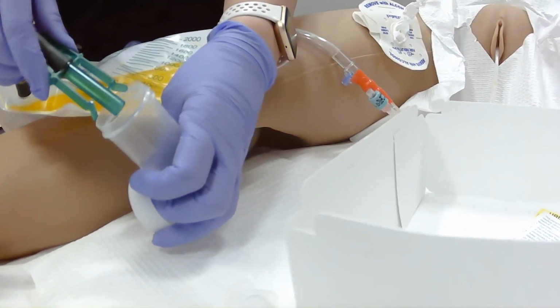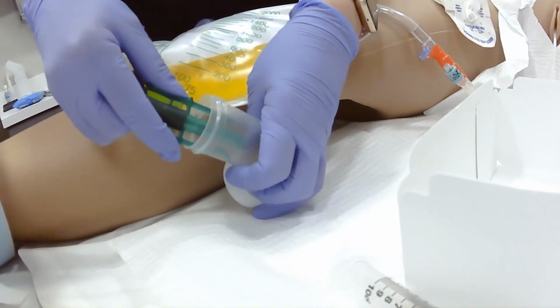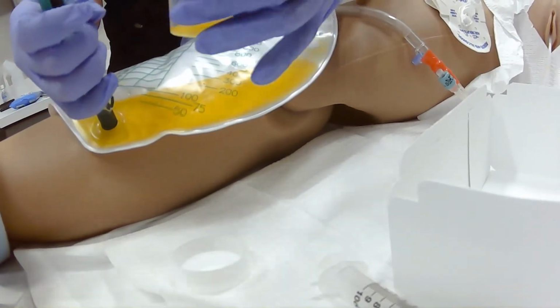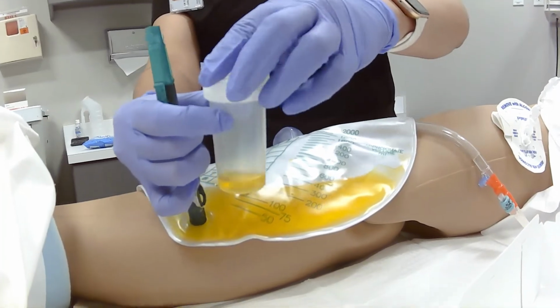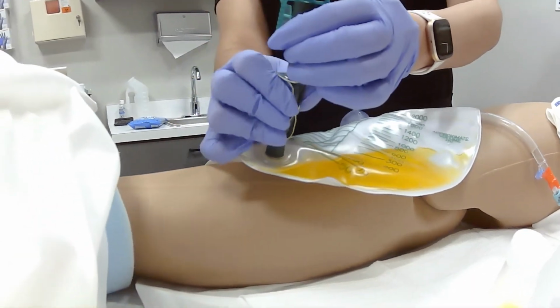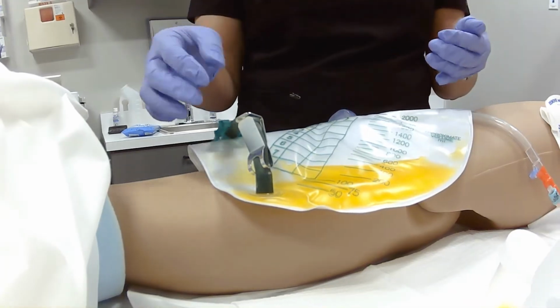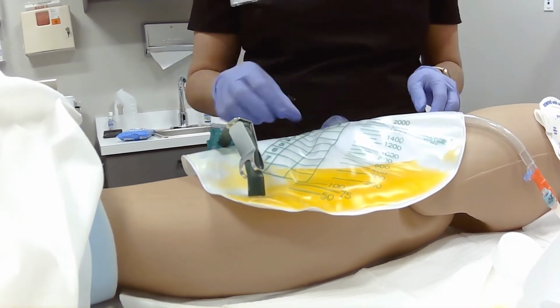And so we would carefully collect that urine specimen as the bag is hanging from the side of the bed, okay? We would make sure that it's filled up a little bit more, and then we would label it with the patient's information and send it to the lab. So that's one way to collect the urine specimen for the initial insertion.